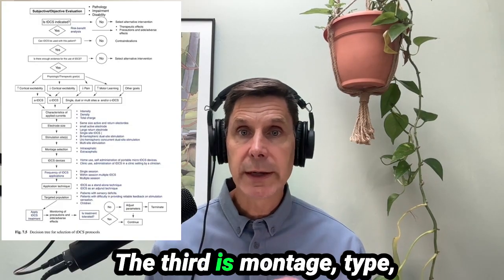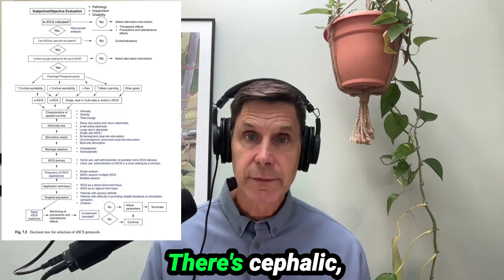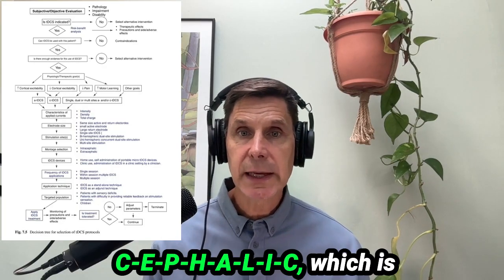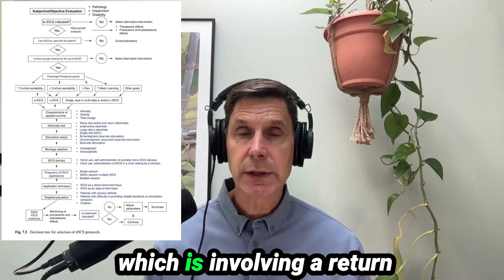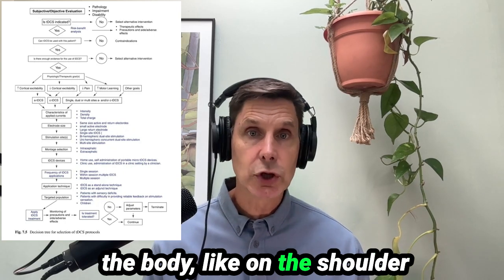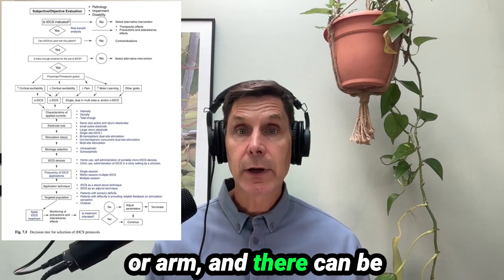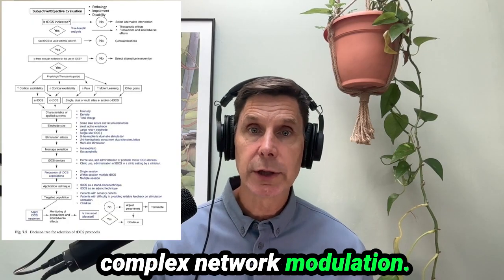The third is montage type, montage or placement. There's cephalic, so-called cephalic, C-E-P-H-A-L-I-C, which is both electrodes on the head. There's extracephalic, which is involving a return electrode on another part of the body, like on the shoulder or arm. And there can be dual site or multi-site for complex network modulation.